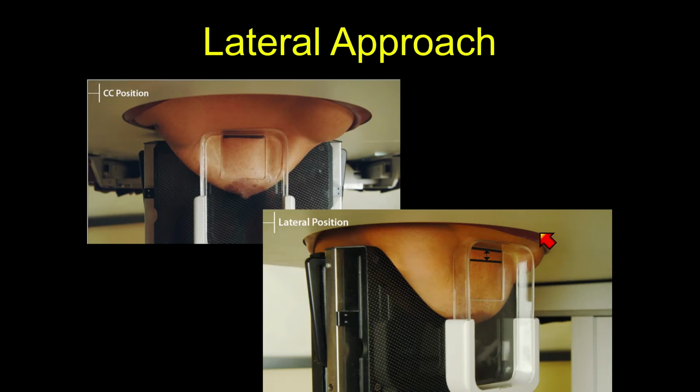Dig the arrow on there. Yeah, I got it. I think it just shows. Yeah. So compared to the cranial-caudal projection, you get more breast tissue posteriorly.